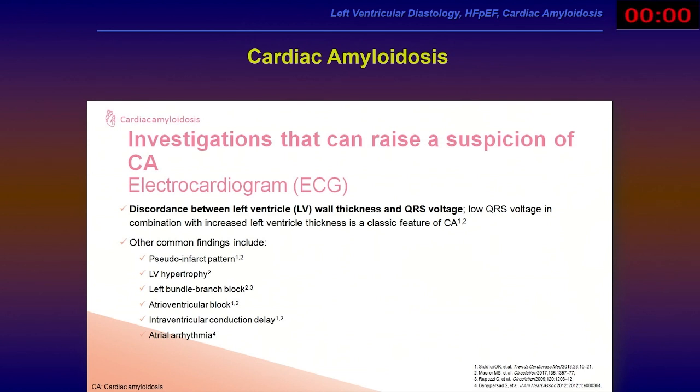But remember, sometimes myxedema patients have this. Myxedema patients will have pericardial effusion that causes low voltage ECG and left ventricular hypertrophy. So it is not only the shape. These are surrogates that when you collect all together, you can reach the diagnosis.